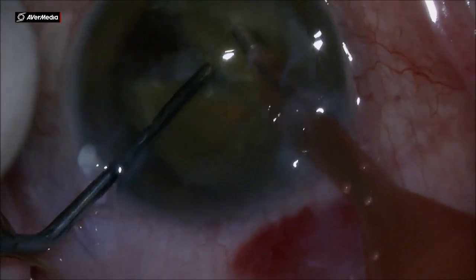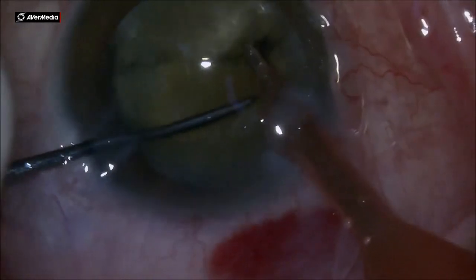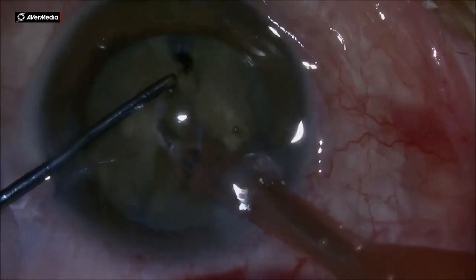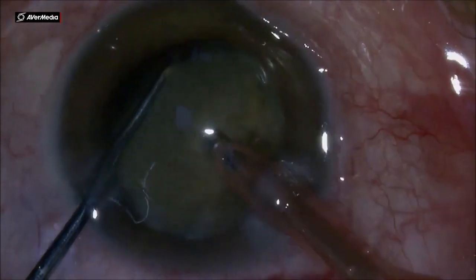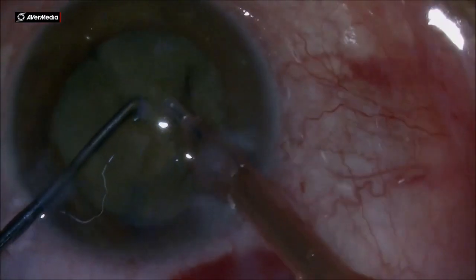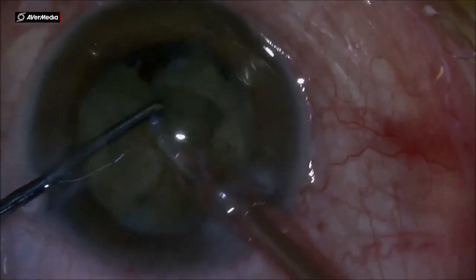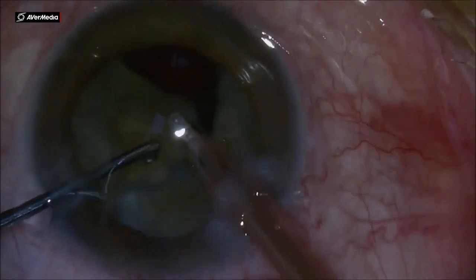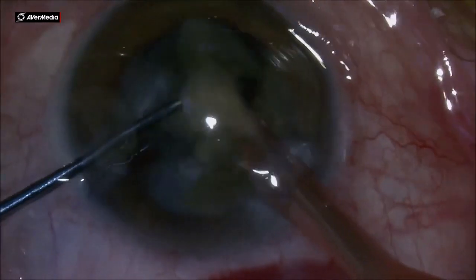Mechanically pushing the back of the nucleus, the back plate, and it's snapping at last. Using the chopper to further chop this leathery cataract, I like to have smaller and smaller pieces to crack the nucleus using the chopper, and not leave the phacoemulsification probe to use the ultrasound to emulsify those leathery parts of the nucleus.